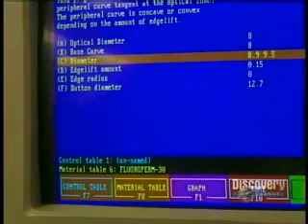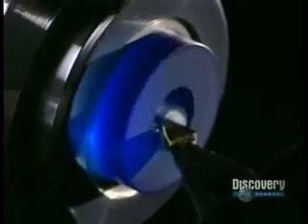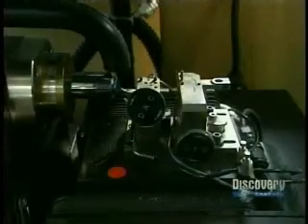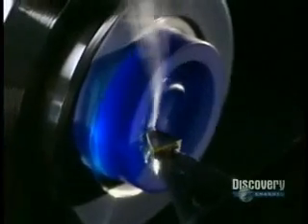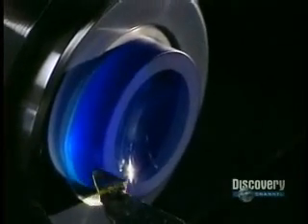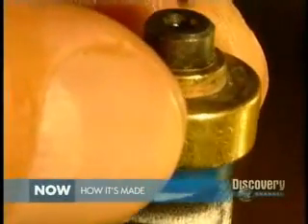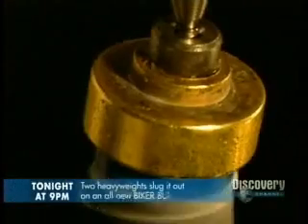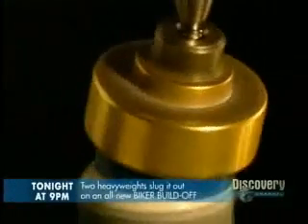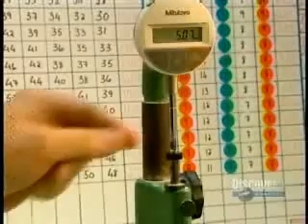The process begins with the data processing control of the shaping. Data is supplied by a computer, which controls a digital lathe. They begin by shaping the inner curvature of the lens. This digital lathe, rotating at 6,000 revolutions per minute, is equipped with an industrial diamond. It shapes the inner surface, the part that touches the cornea. It must be free from any abrasions and imperfections, and is polished with a superfine abrasive paste. Polishing is a crucial step because it assures excellent comfort and perfect vision.